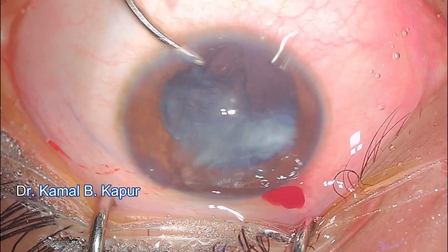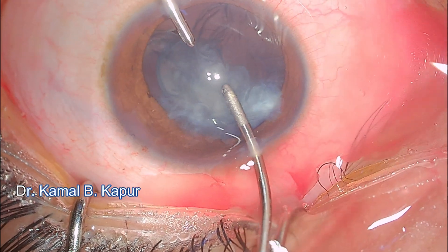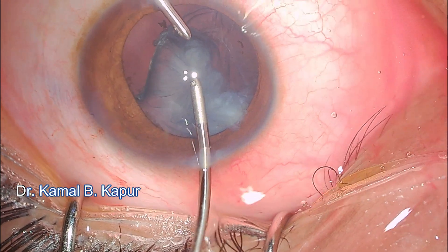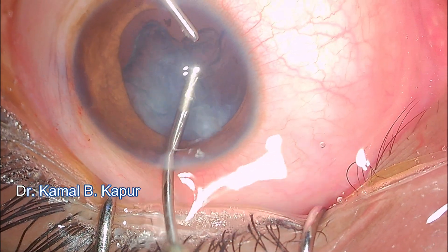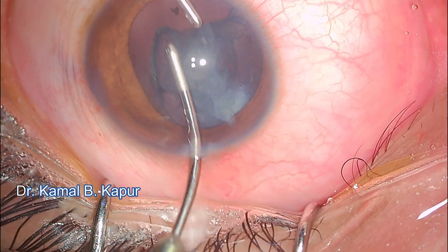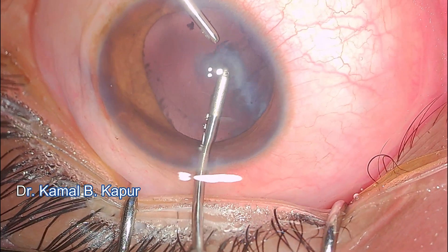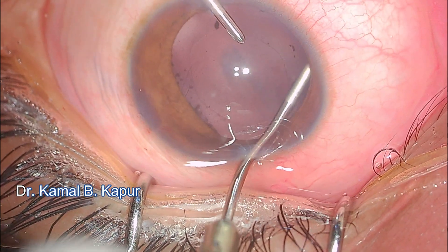I make another side port. Rather than coaxial irrigation-aspiration, I prefer a controlled bimanual irrigation-aspiration here. Since the cataract is totally cortical and soft, there is no need for phacoemulsification. We proceed with controlled bimanual irrigation-aspiration, and total cortical removal is achieved.